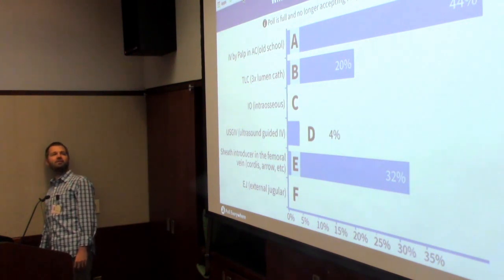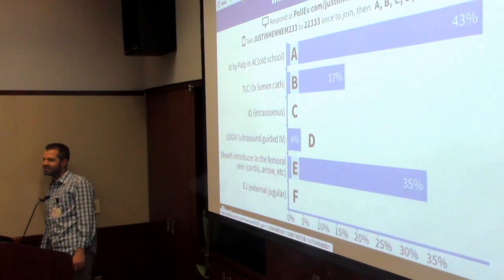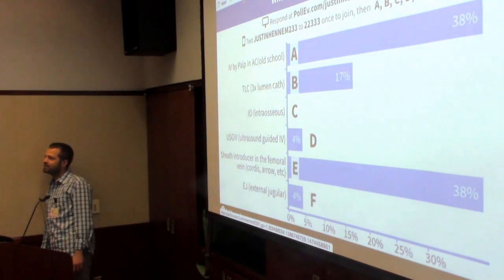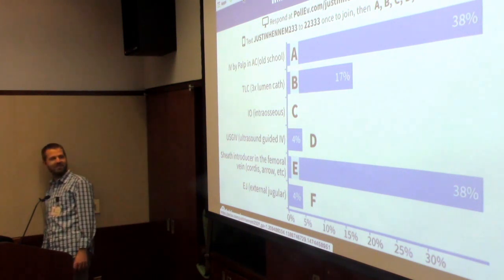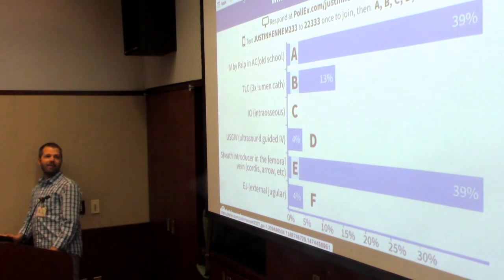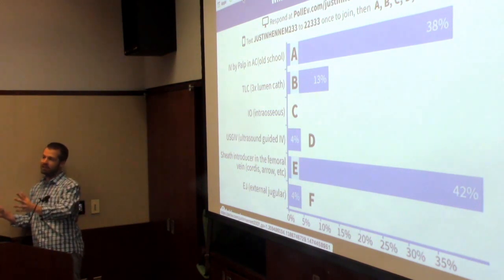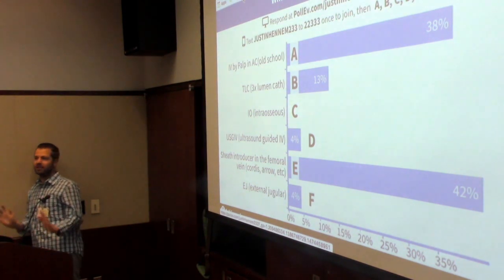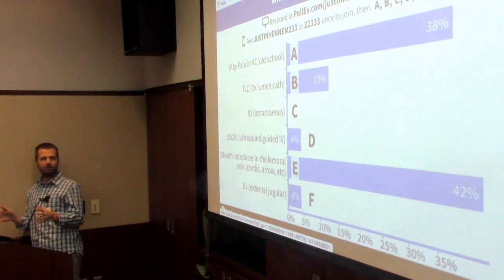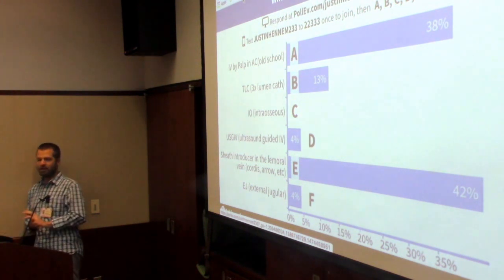Okay, so about a third of you said sheath introducer. Why? Larger. What's the benefit? Can give them more blood faster. Okay, and why is that? Faster. All right, short large tube, and we're going to go over why that helps. So what is your goal? What are you trying to do for this person? You're going to give her blood, or she's going to die. So you need to put blood into a human being. A triple lumen catheter may not be your best bet, and we'll remind you as to why it's probably not your best bet. Last case. So again, you can remodify your answer.